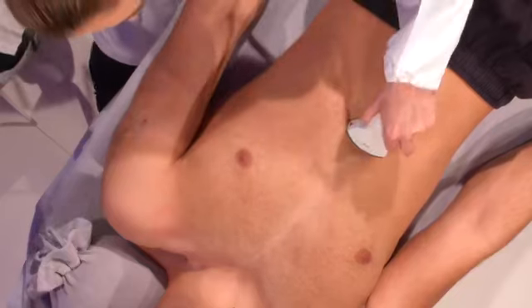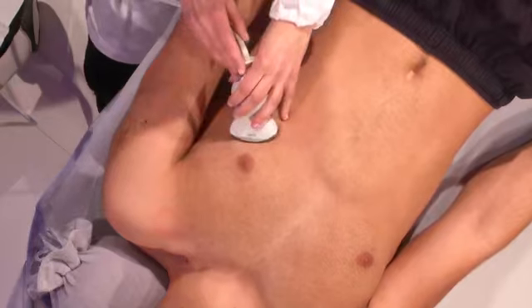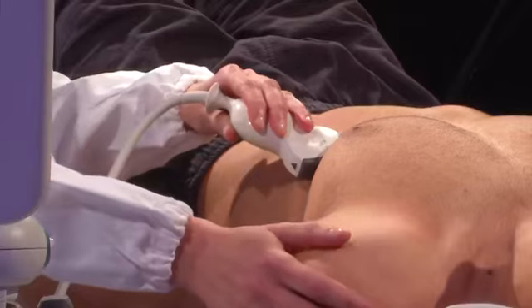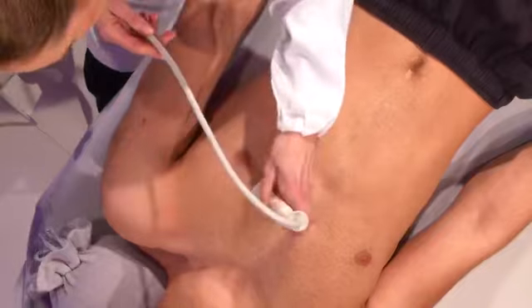And the FATE protocol consists in scanning the subcostal view, like this, and then quickly moving to the apical four-chamber view. And your patient, of course, is in shock, so the patient will be supine. And then moving to the parasternal view.